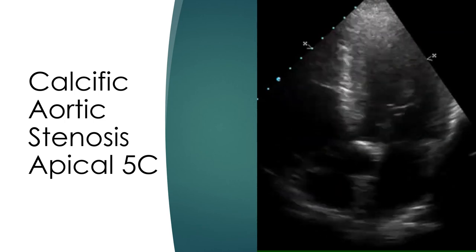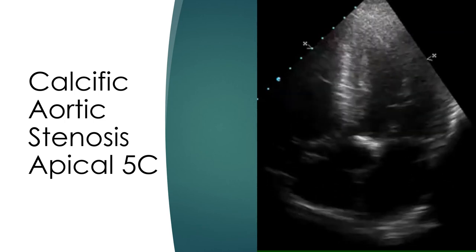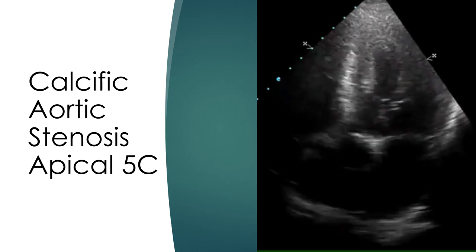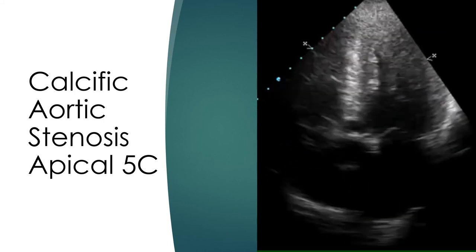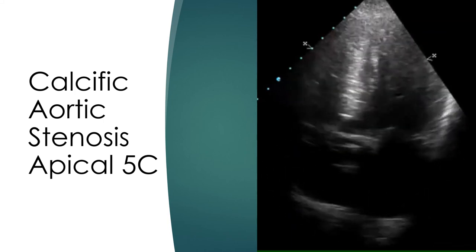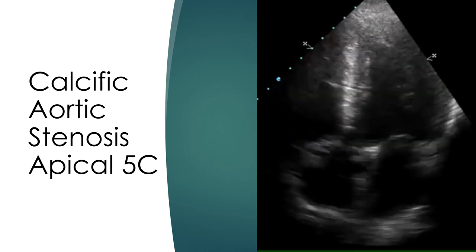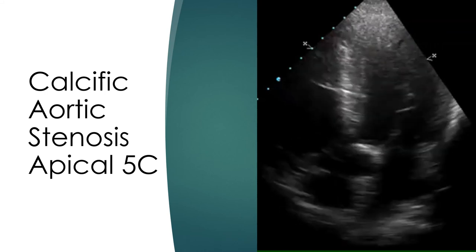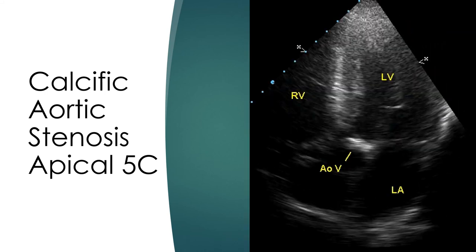Another view used for estimating the gradient is the suprasternal view, especially when associated mitral regurgitation gets picked up by the Doppler beam giving a falsely high gradient from the apical 5-chamber view. Still frame from apical 5-chamber view showing four cardiac chambers and the aorta with calcified aortic valve. The interventricular septum can be seen thickened as part of left ventricular hypertrophy.